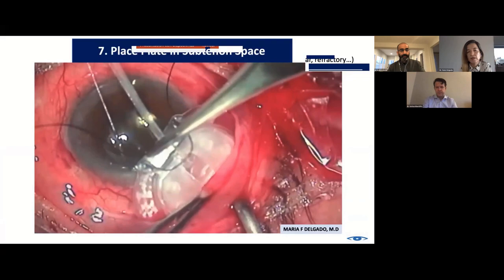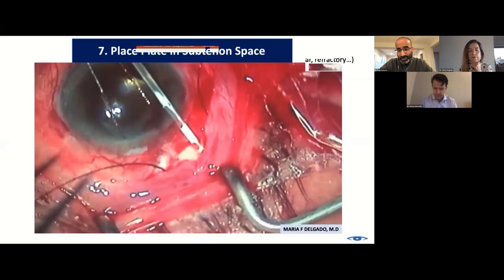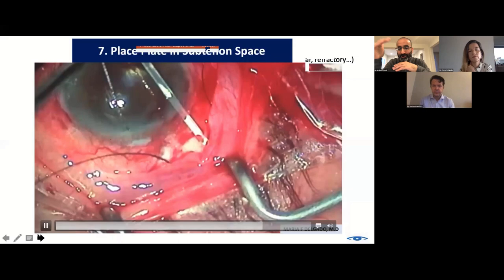And then that's perfect, by the way. Yeah, looking at what you just did, I think is kind of the example that we were talking about. This is an expert surgeon doing it, of course, but there's no kind of spitting out of the plate. So perfect example of it.